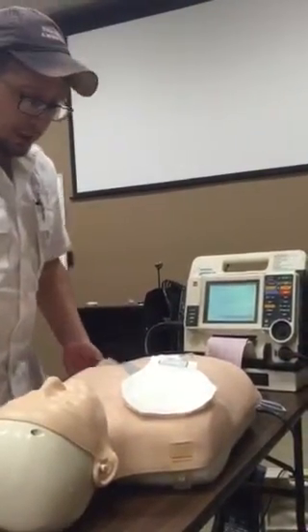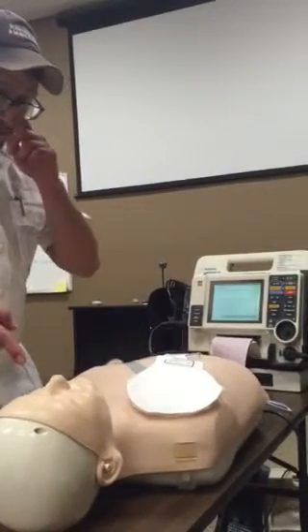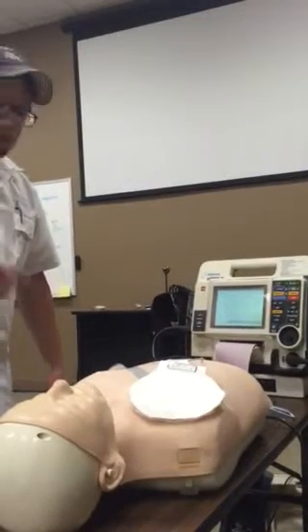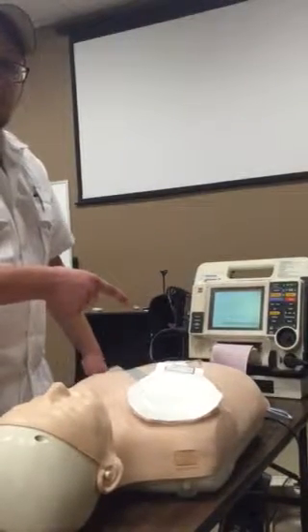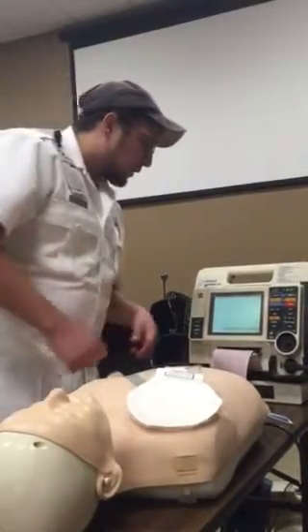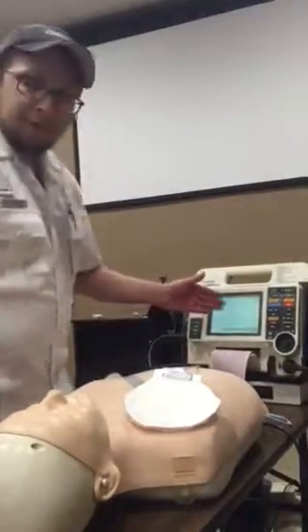I'm gonna continue CPR. I'm gonna get IV/IO access. Consider it done. I have an advanced airway. I'm gonna give 1 milligram epinephrine. All right. And I'm gonna do 2 minutes of CPR. Okay, your 2 minutes of CPR are up. Okay, I'm gonna reassess my patient. Is this the rhythm that I see on the monitor? It is. Okay, looks like VFib on the monitor.